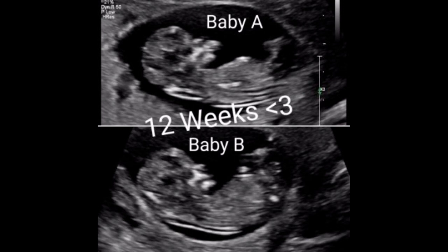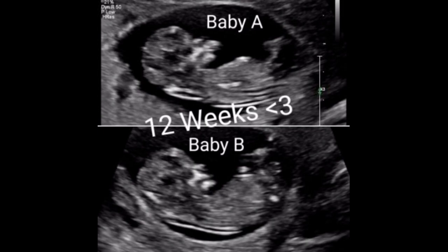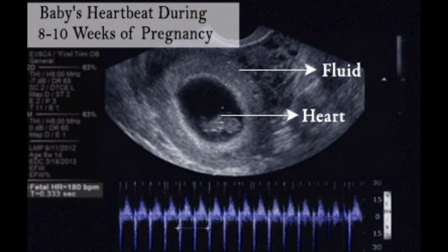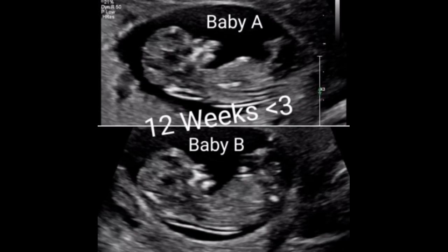Once the fetus's crown rump length surpasses 7 mm, a heartbeat should be detected by ultrasound. If no heartbeat or cardiac activity is detected, then the pregnancy is likely a missed abortion.